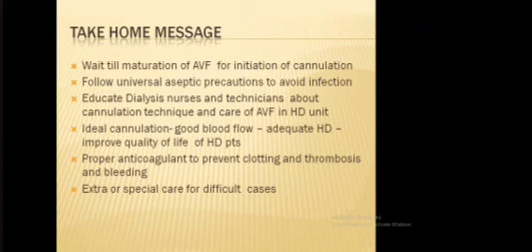And follow universal aseptic precautions against infection. Educate our dialysis nurse technicians about cannulation technique and care of the AVF in the HD unit. Ideal cannulation gives good blood flow, adequate HD, and improved quality of life for the HD patient. Use proper anticoagulation to prevent clotting, thrombosis, and bleeding. And extra or special care for difficult cases is very important.